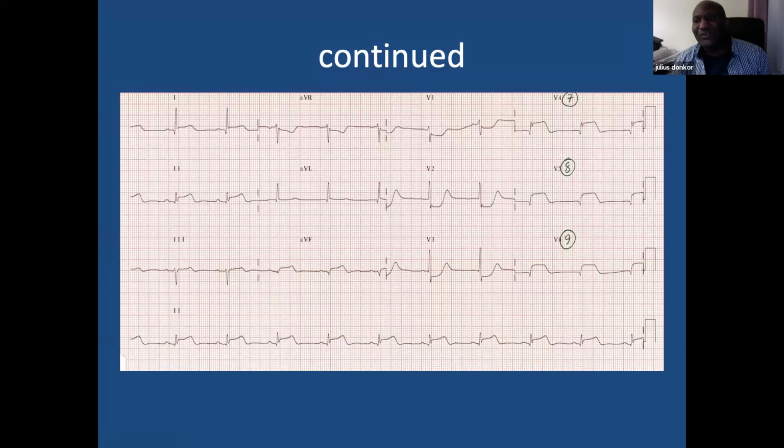Yeah, so you don't need to do that. Some registrars might end up wanting to do that. I mentioned that just in case somebody wants to do it, that it will be opposite, because your V1 to V3 is looking at the front, the anterior part. So it's always going to be upside down.